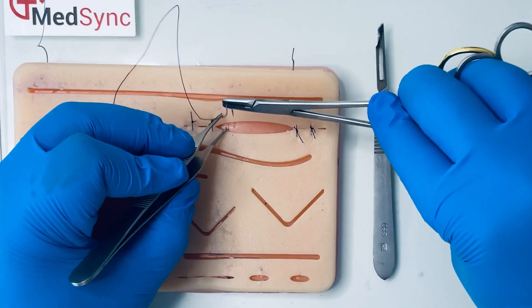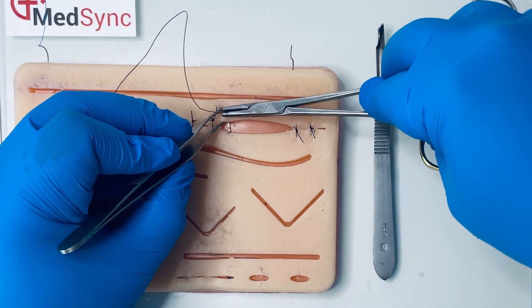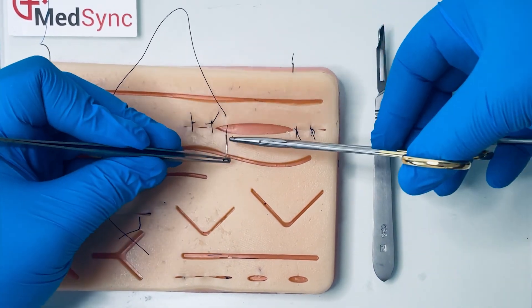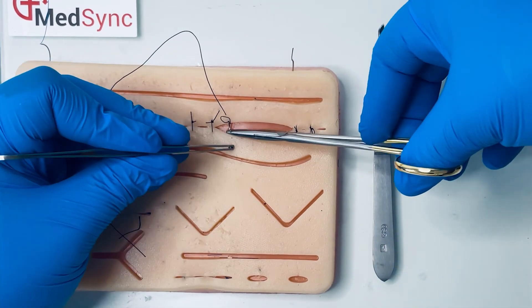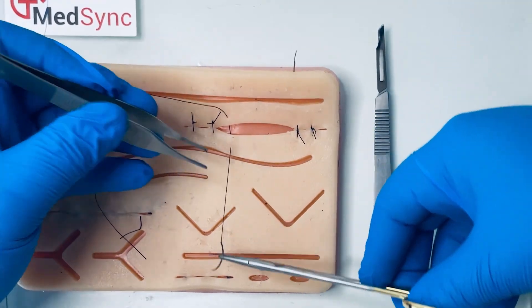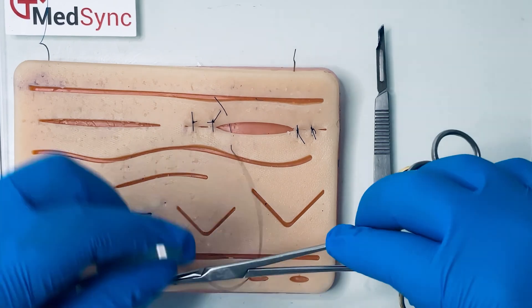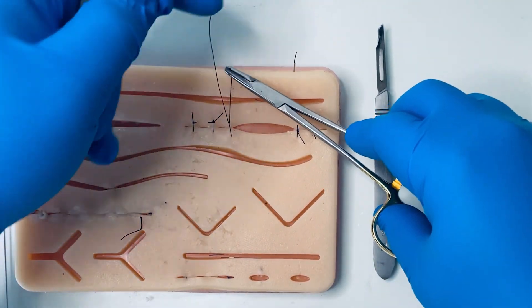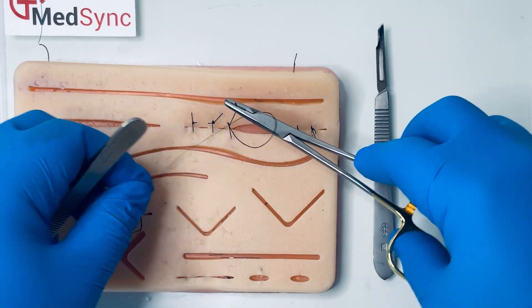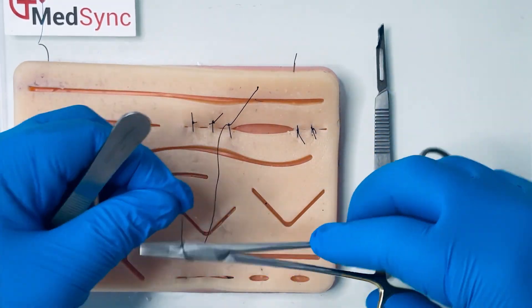And in technique two, you hold the knot. This is performed by laying your surgeon's knot in the first instance. Once the desired approximation has been achieved, the short end is used to pull the knot to the same side as the long suture and the final reef knots are laid to secure the knot.